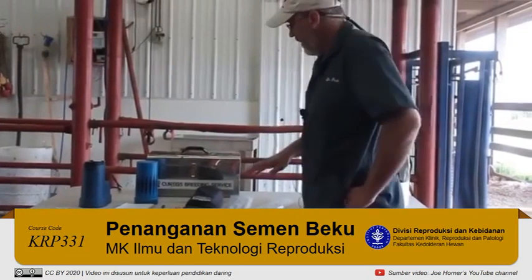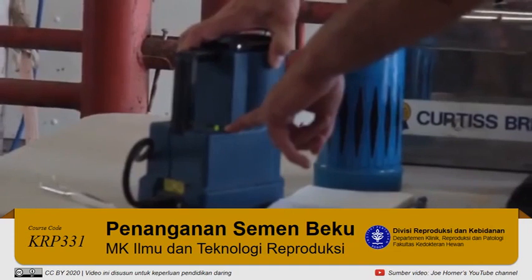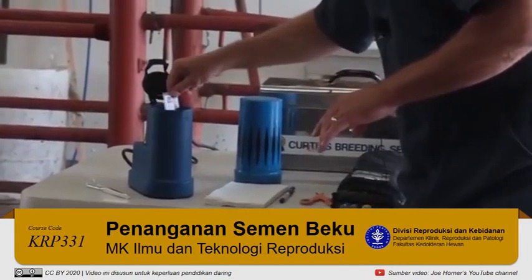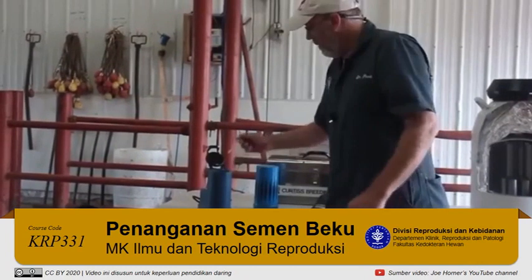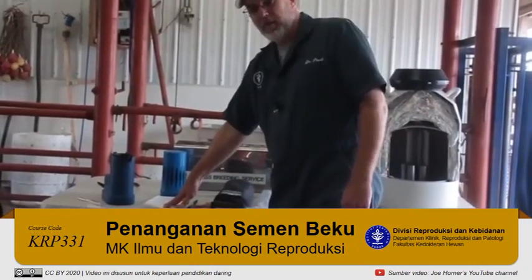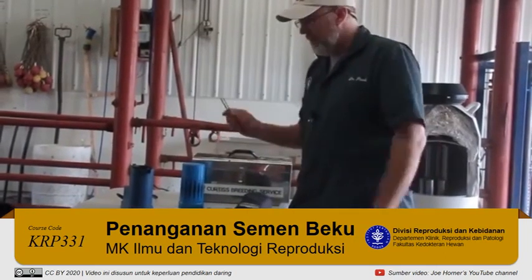Before we thaw semen, we always want to make sure we have everything we need. We have a thaw bath — if the green light is on, it's roughly 92 to 96 degrees. I never completely trust that, so I always have a thermometer in the thaw bath. Bull semen is pretty sensitive to changes in temperature, so once it's warmed to the right temperature, you don't want it cooling back down or getting warmer. We also want paper towels to dry off the unit of semen, scissors to nip the end of the straw, and tweezers to collect the straw from the tank.